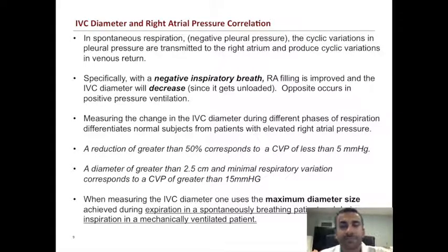change. So it's important to realize, why are we looking at the percent change of the IVC diameter? Well, it tells us essentially the pressure that's transmitted to the right atrium, because again, a higher pressure would be able to fight off those pressure changes of the thorax and then have less of a change in the diameter compared to a lower right atrial pressure.